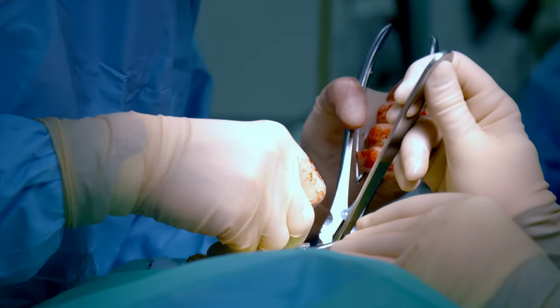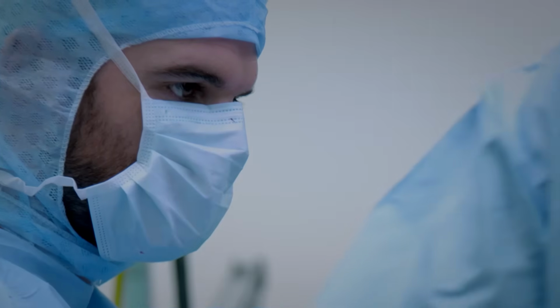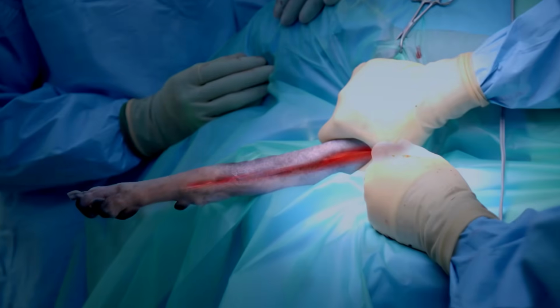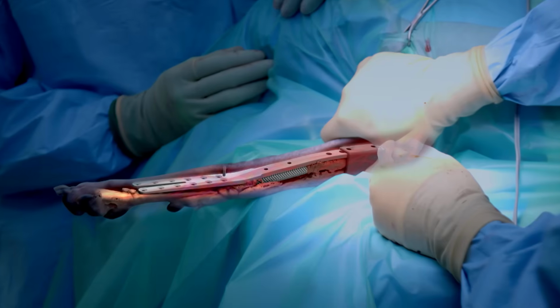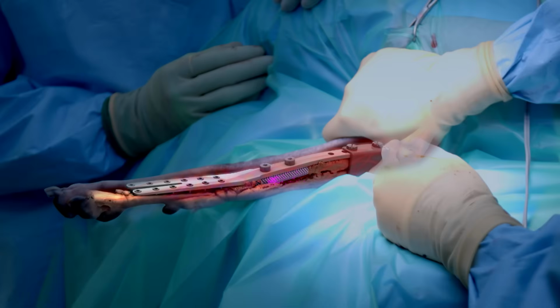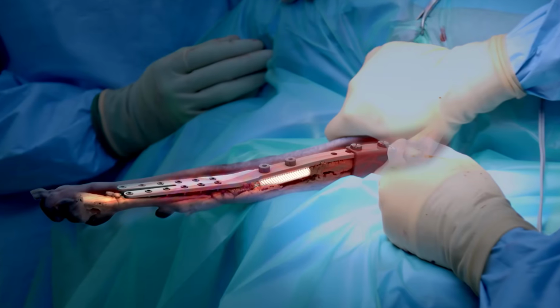So we're going to take out some bone marrow from the pelvis. The stem cells will be extracted from the bone marrow. Then they'll be mixed with glue and sprayed into the titanium mesh. Number 11 blade, please. First, Noel will take out the old implant. After cutting out the dead bone, the gap will be bridged by the block of trabecular titanium mesh. The mesh will then have bone marrow stem cells sprayed into it. And hopefully over several weeks, these cells will grow through the mesh and solidify, creating 4 centimetres of new bone.